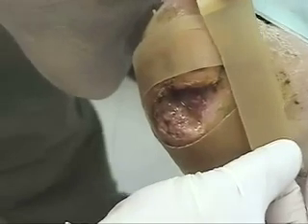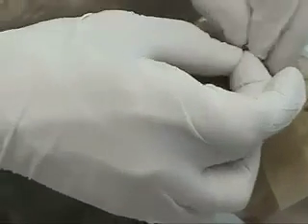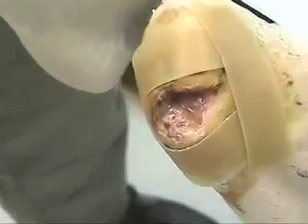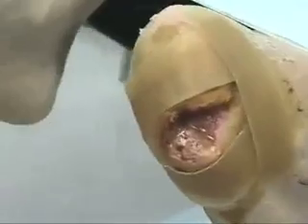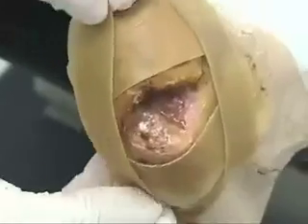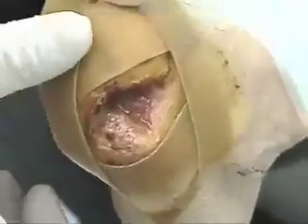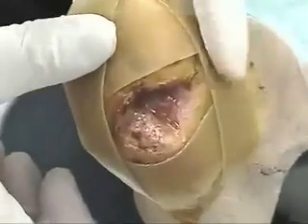which you see here cut into strips, will be able to be applied much more easily to the periphery of the wound. It's very important to have this applied well so as to trap the larvae in the area that you want to have debrided. That's what you see being done here along all lengths of the wound.